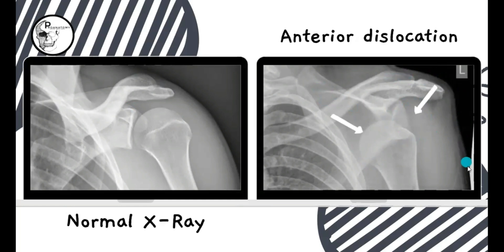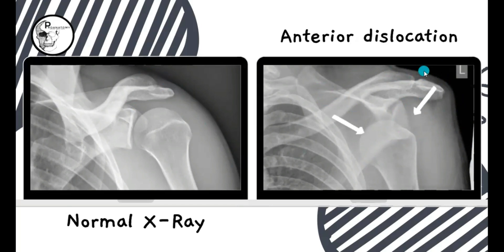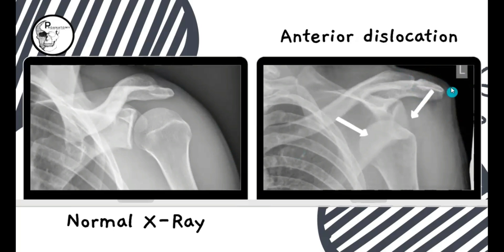You can also make out the difference in the soft tissue outline. There was a noticeable convexity on the normal side, whereas in the dislocation you can see flattening of the curvature just below the acromion process of the scapula — that is the deltoid muscle. This flattening is also a typical sign of shoulder dislocation.